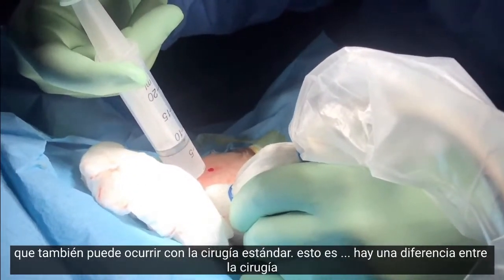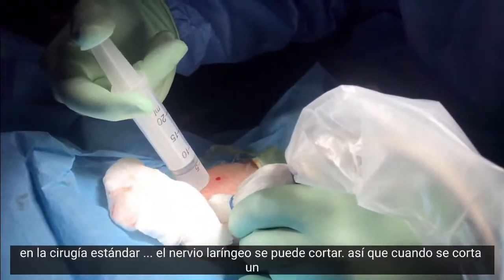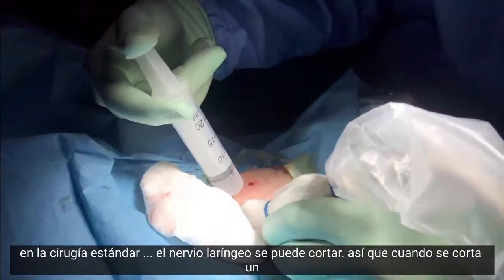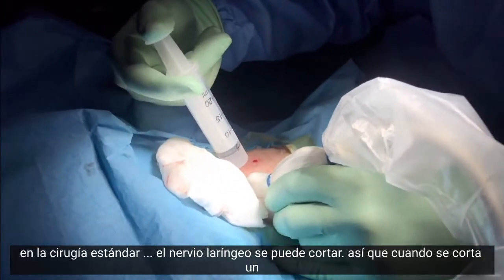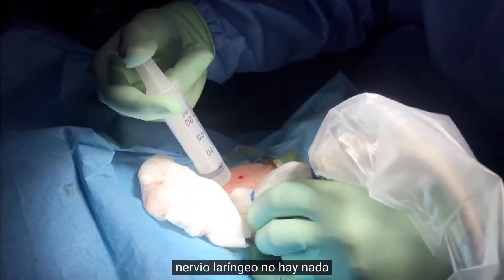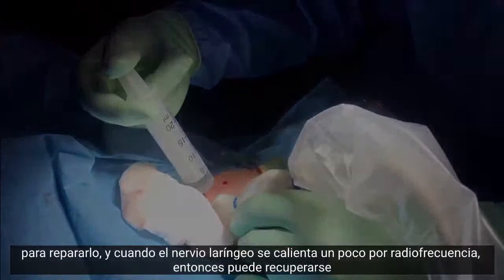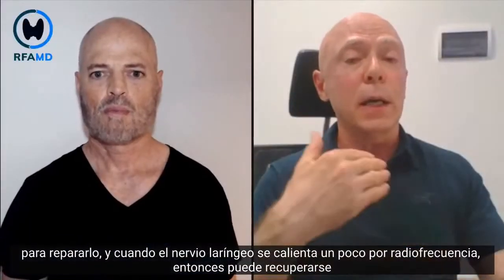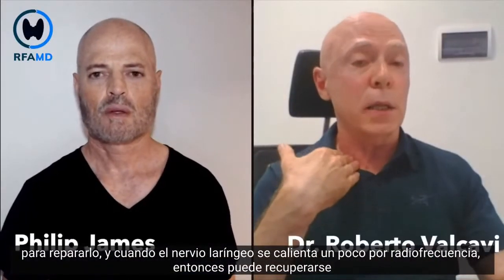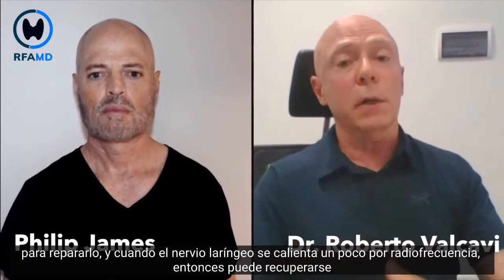There is a difference between surgery. In standard surgery, the laryngeal nerve can be cut. So when the laryngeal nerve is cut, there is nothing to repair it. And when the laryngeal nerve gets some heating by radiofrequency, then it can recover. Mm-hmm. Well, that's good news.